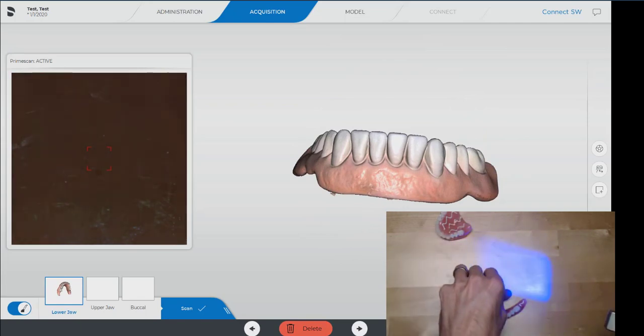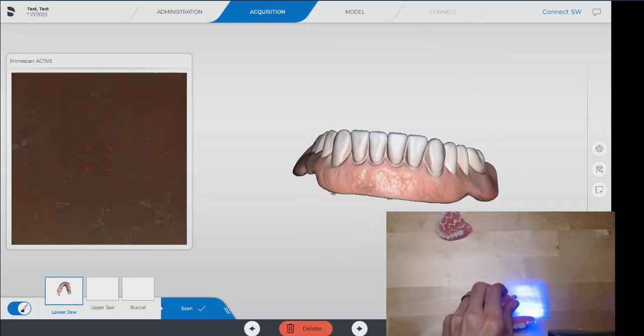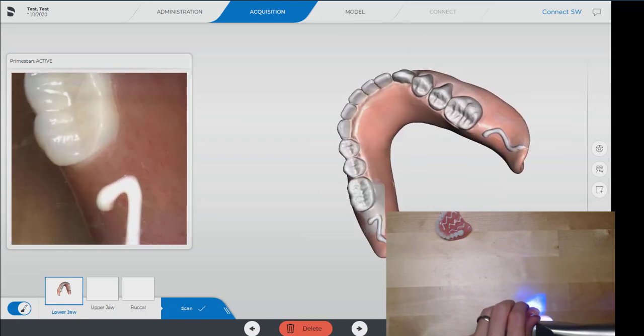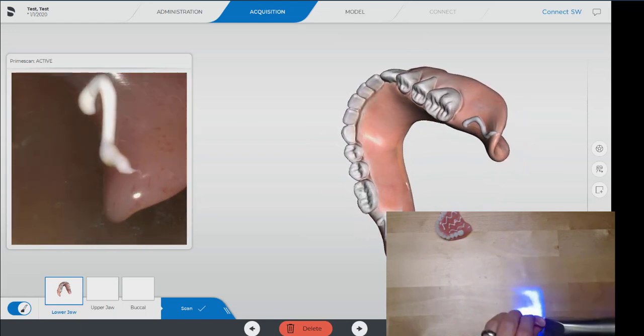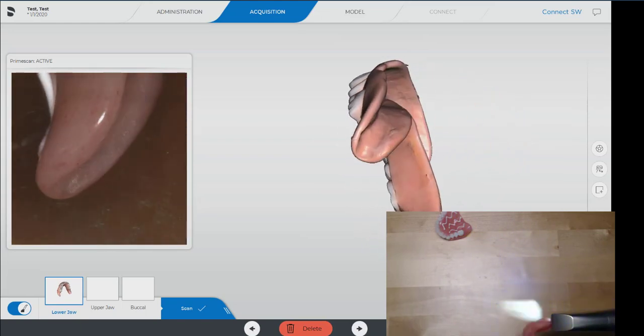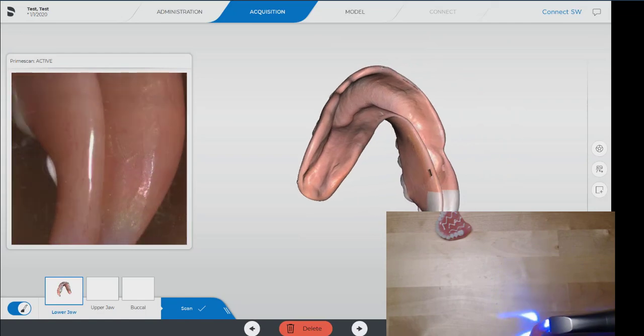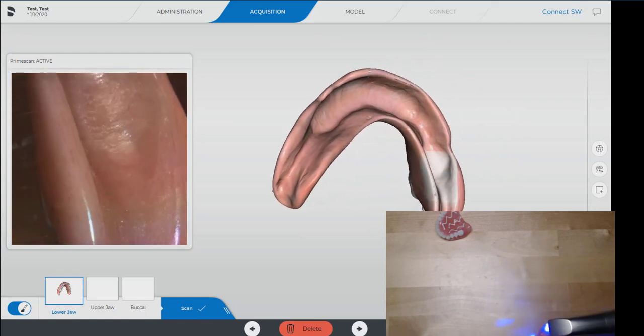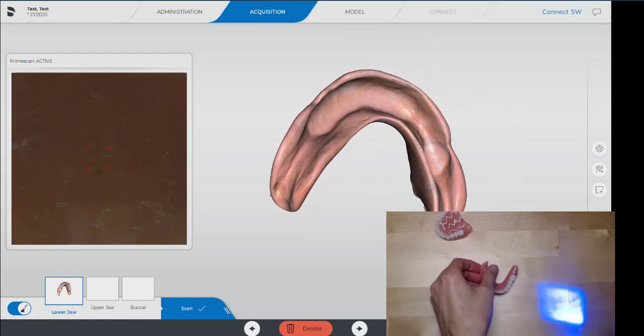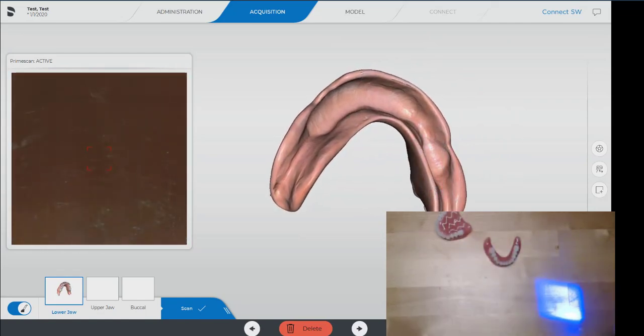We've lost one marker there, but we've already got that area, so we should be good. Very good. I believe that was the last little spot.